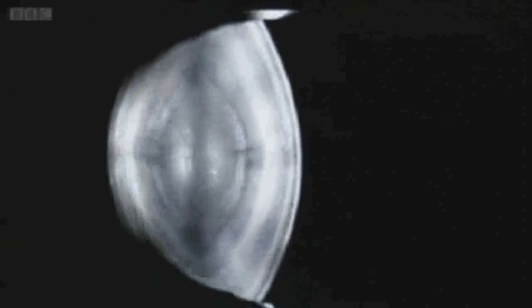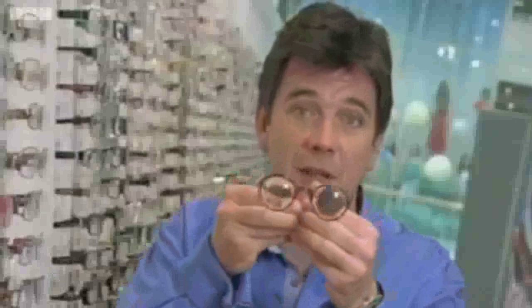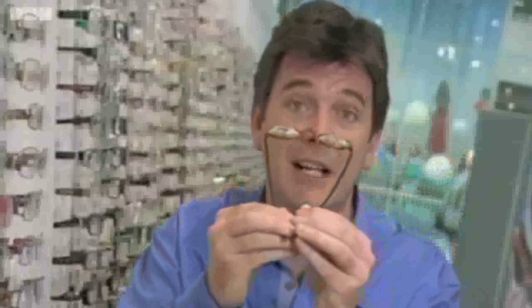So a cataract is a clouding of the lens which can't be reversed. To solve the problem, you have to remove the lens through a hole in the eye. But without lenses, our eyes can't focus. This was the challenge that Ridley took on. Up until the 1950s, these were the only solution: thick magnifying glasses. Now, not only did they not look very attractive, you still got blurred vision and a lot of distortion. Ridley was convinced there must be a better way of helping restore people's sight.